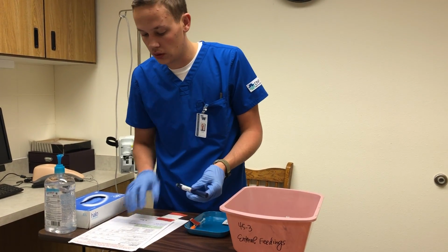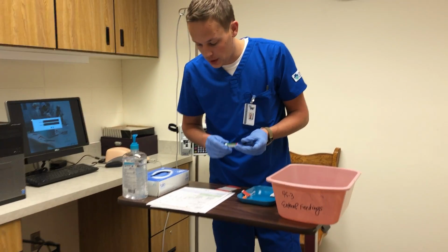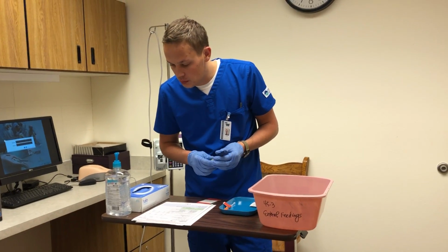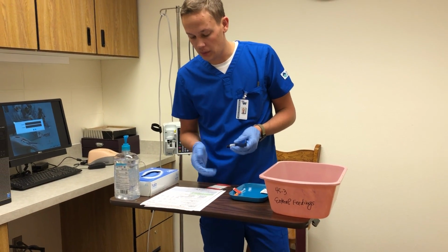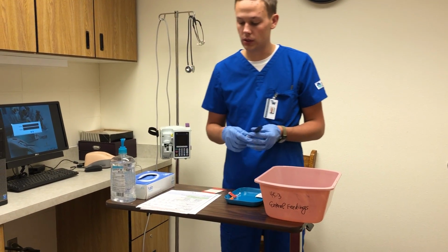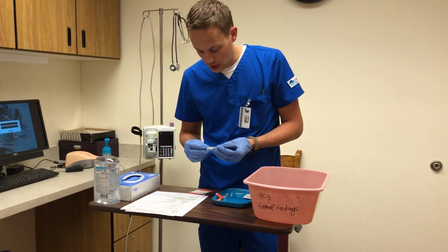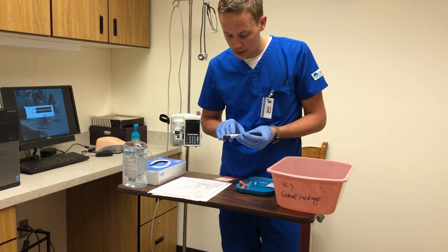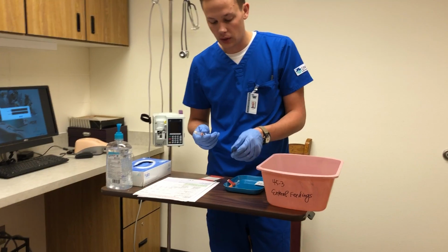and I can go on to drawing up the insulin pen. So again, with the insulin pen, the client's blood sugar was 178, and with the sliding scale I'm given, it's 150 to 200 is 2 units, so that falls in between, so I'm going to be giving 2 units. So again, I'll just check to verify this is the right one, so it's that practice insulin Lispro U100, and that matches my MAR.